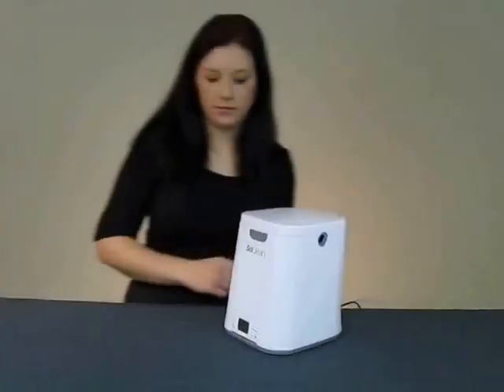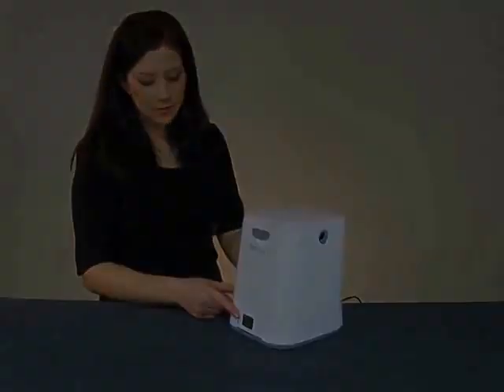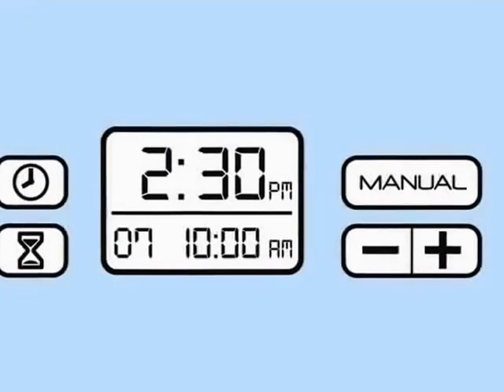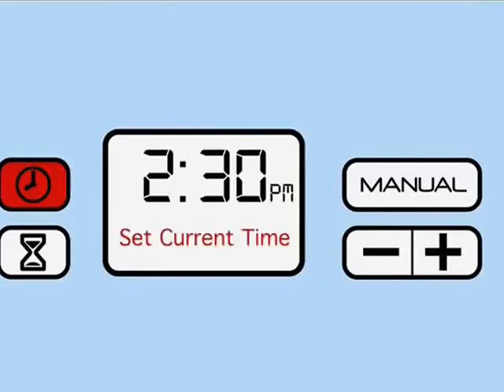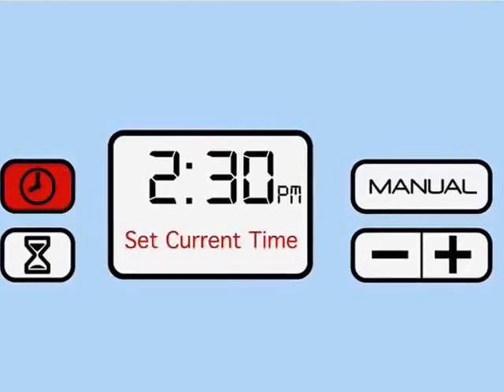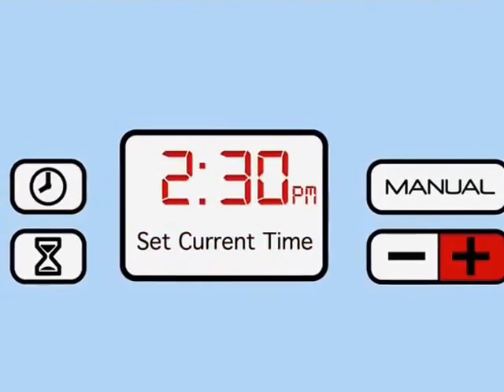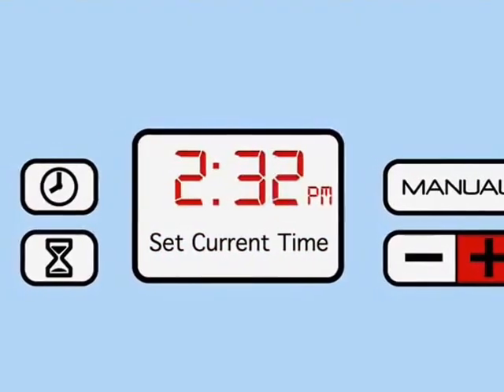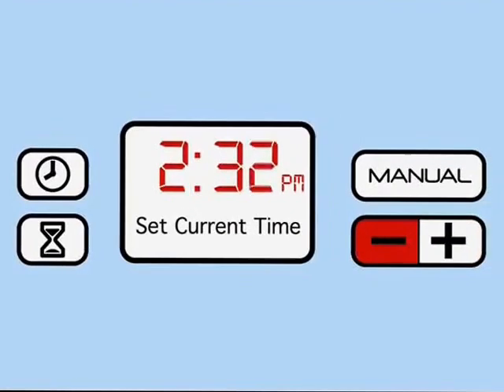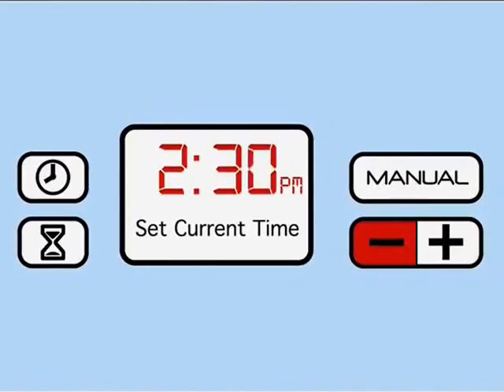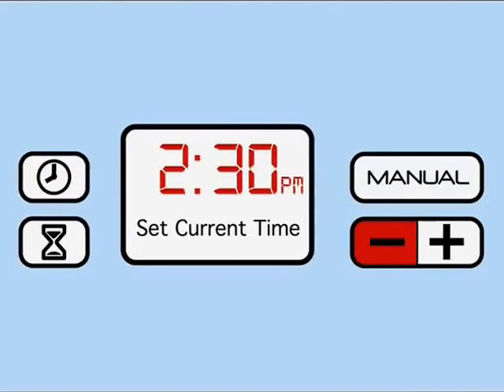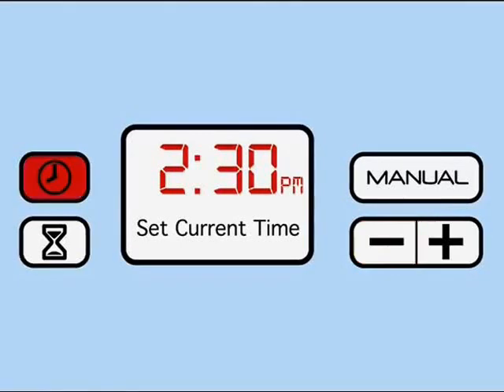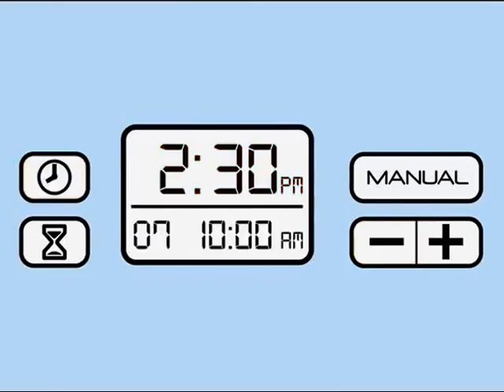Now set your clock by pushing the button with the clock icon. This will prompt you to set the current time by pushing either the plus or minus button until your current time is reached. Then push the clock button once more to store your time and to return to the home screen.